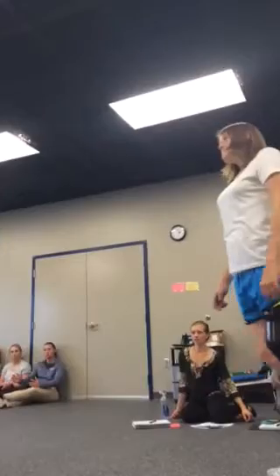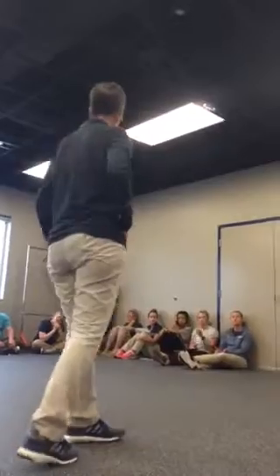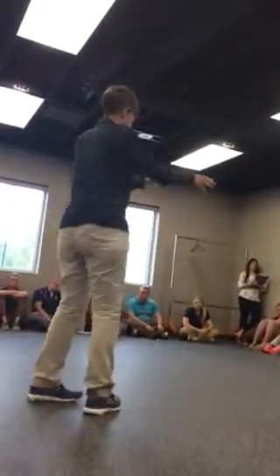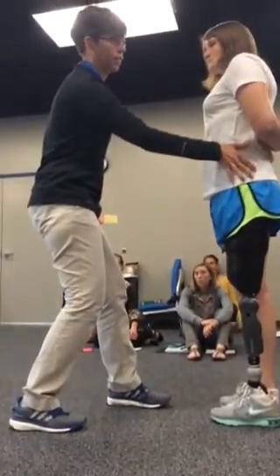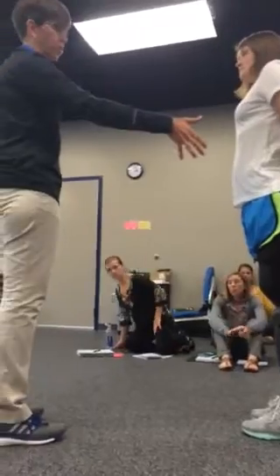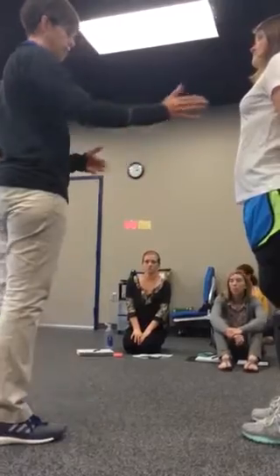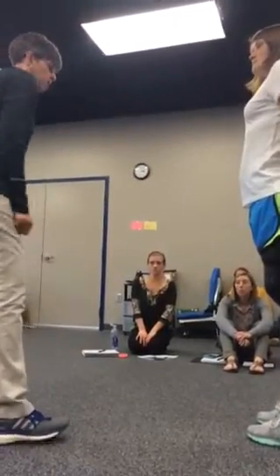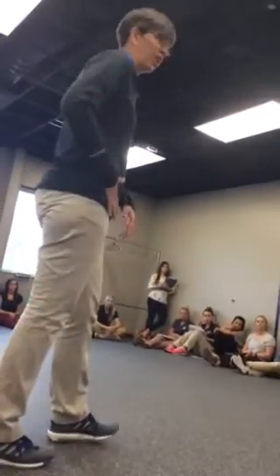Okay. Did you see what was going on? Right? When it's supposed to be going this way? So you can see that, and if I'm showing somebody, I like to put my whole hand on, because what you're going to see is it's going to go like this, right, on the hip, as it's rotating backwards and posterior. What we want is we want both to come into the hands alternately, but a lot of times that one disappears, okay? So what does that mean? It means that she's doing really, really well, except we could probably talk her into getting over her toe just a little bit more and bringing that pelvis forward.